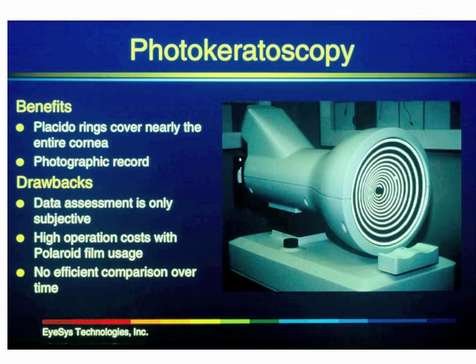Well, that's well and good. We can see the rings and compare them in a gross sense, but there's nothing quantitative here. And we still haven't answered the question, how distorted do the rings have to be for us as observers to say, well, I can recognize that this portion of the cornea is steeper, this portion is flatter.